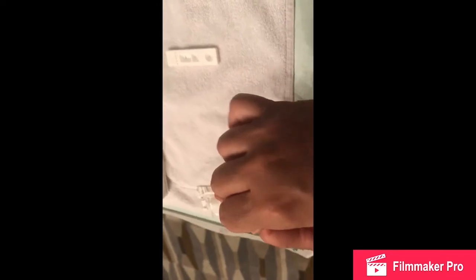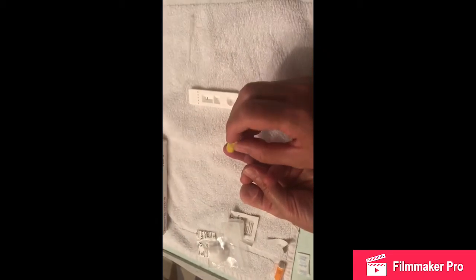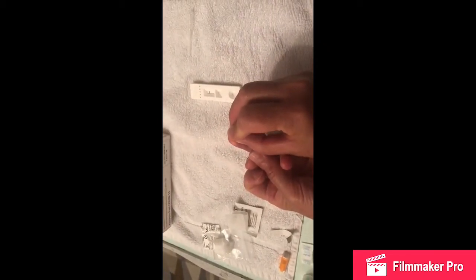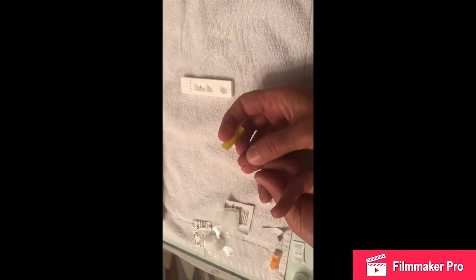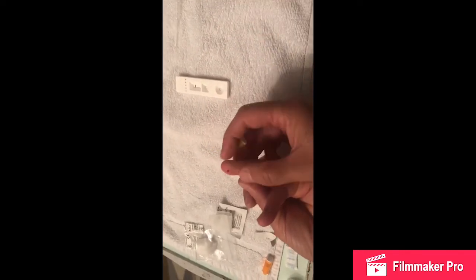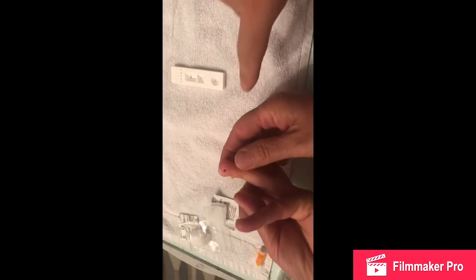Okay, so that's the needle. One of the fingers will do — you put pressure on it. If you give it a little squeeze, blood will come out.